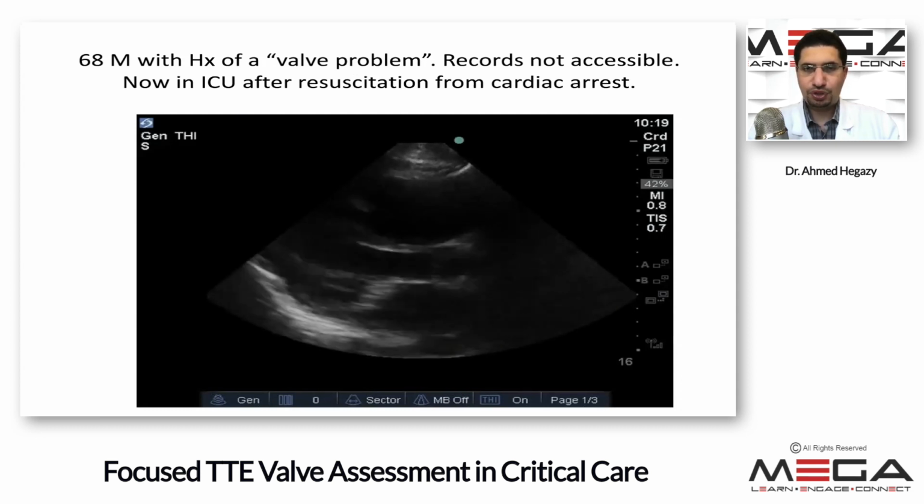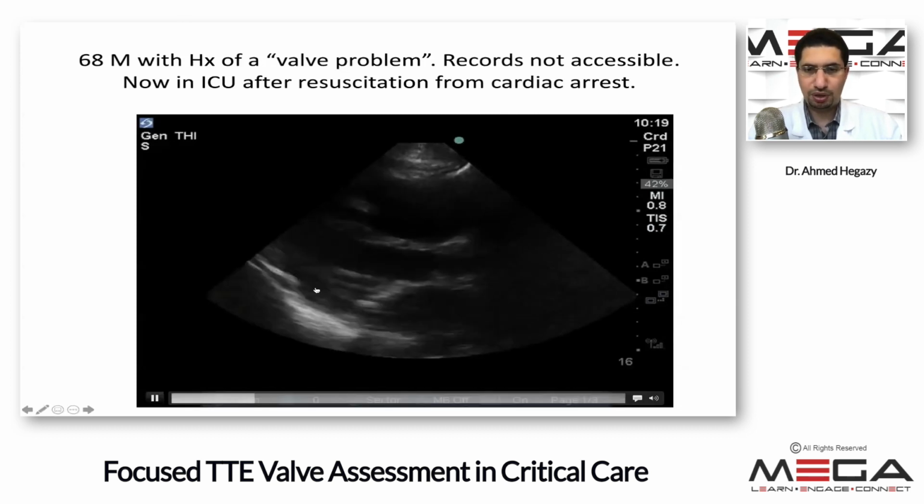And then after resuscitation from the cardiac arrest, this is our point of care ultrasound. We're trying to understand what this valve problem is that this patient had told us about before he went into a cardiac arrest. And basically, this was what his mitral valve looked like.